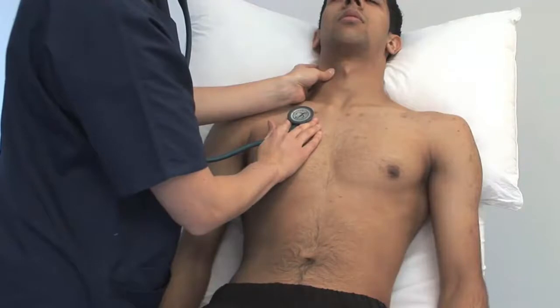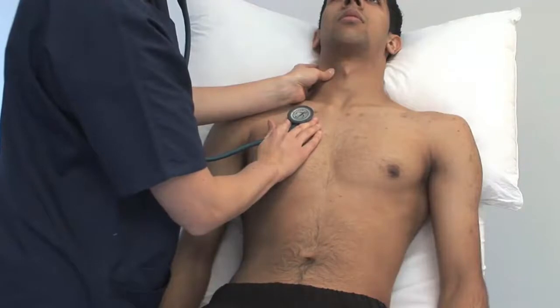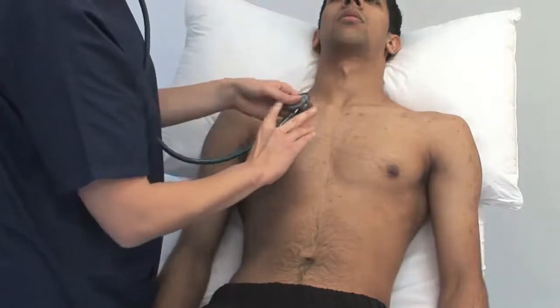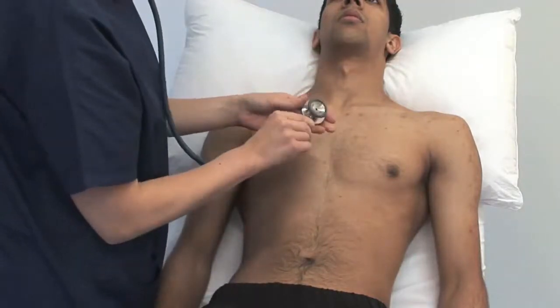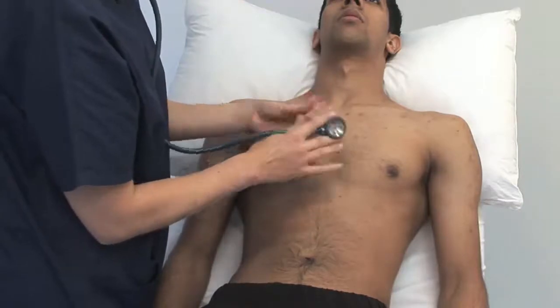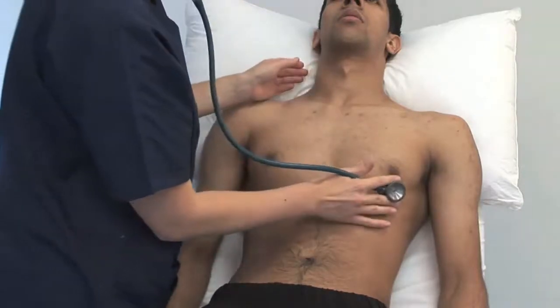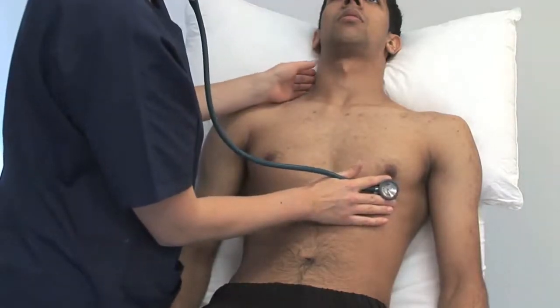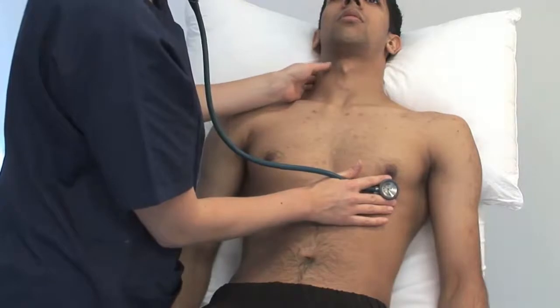Soft diastolic murmurs are sometimes no more than a so-called absence of silence. Listen to the precordium systematically with the bell and then the diaphragm.